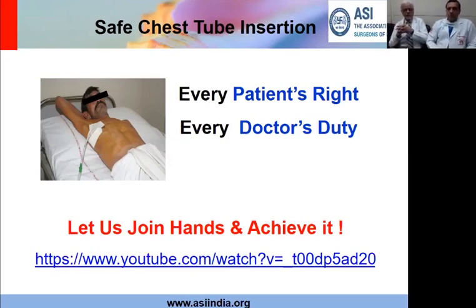Regarding removal after the lung has expanded, you mentioned that if the lung has expanded, even if the fluid in the chest tube is in the range of 100 to 200 cc and it is clear fluid, this is the time you can take it out, as the patient is getting better. What happens to the column in this situation? Would the column keep on moving? There has been some misconception that if the column has stopped moving, can we take it out? Is that something that will happen, or will the column keep moving as long as the tube is in?